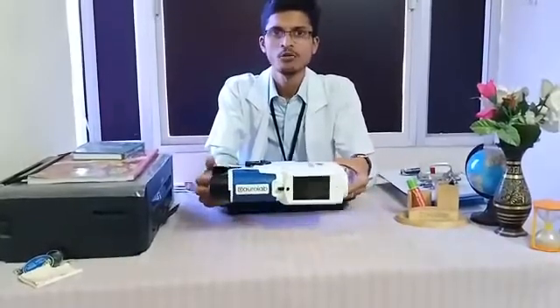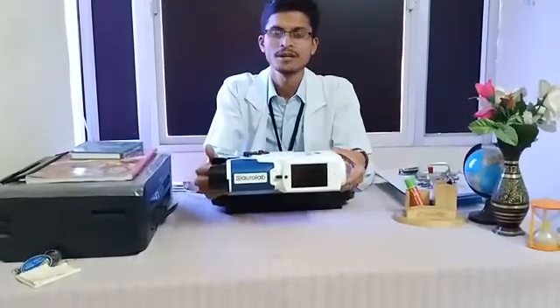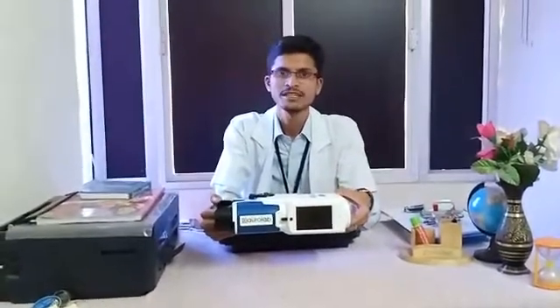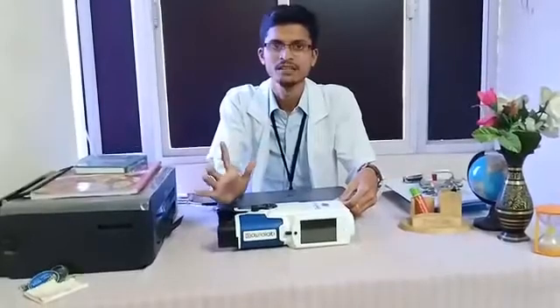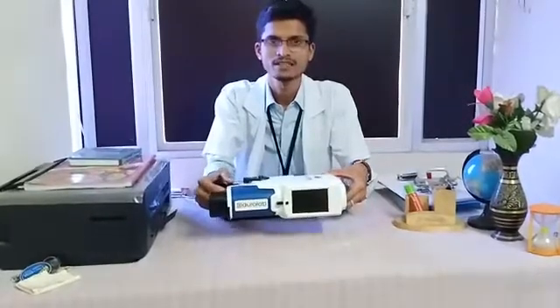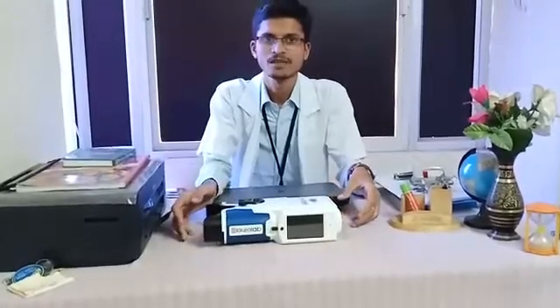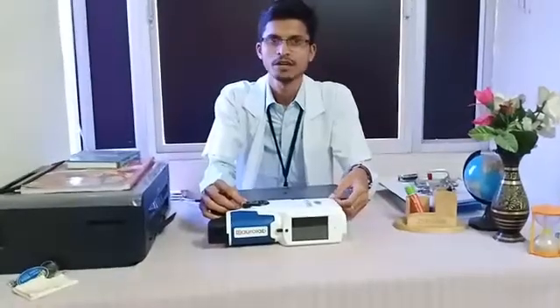I would strongly suggest this to all ophthalmologists, independent practitioners doing refraction by themselves, and to budding optometrists — you can definitely use this instrument for better accuracy. Nowadays patients are oriented toward technology; whatever you do with retinoscopy, their first question is whether you have a computerized eye test. For that reason, I would suggest everybody to buy this instrument. Thanks to Aurolab for creating such a wonderful instrument that is economically accessible for patients, and thank you for giving me this opportunity.